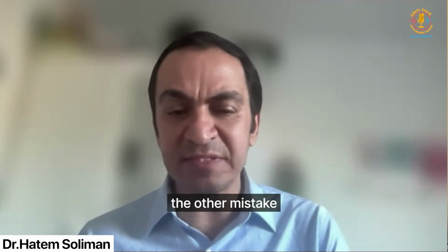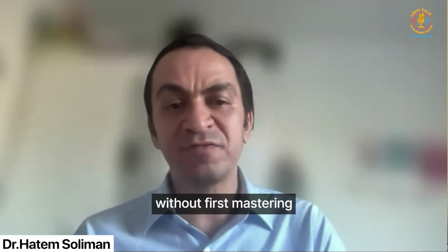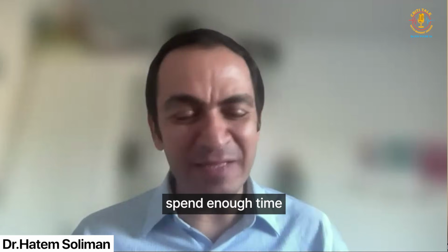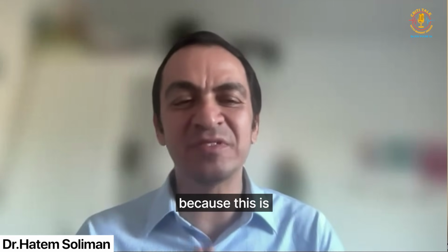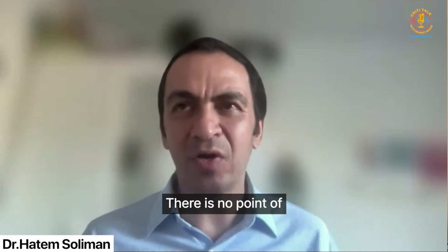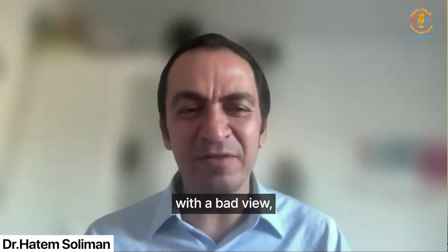And the other mistake is jumping into the excitement of measurement without first mastering the views. I always tell my learners, spend enough time learning the views, because this is the foundation of what you will do. There is no point in doing the best quantification in the world with a bad view, because the results will be poor.